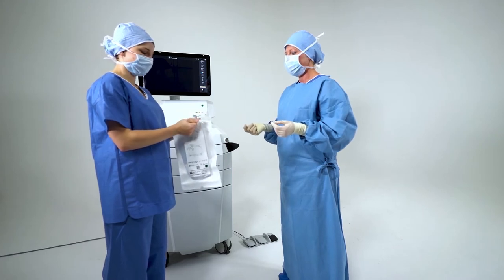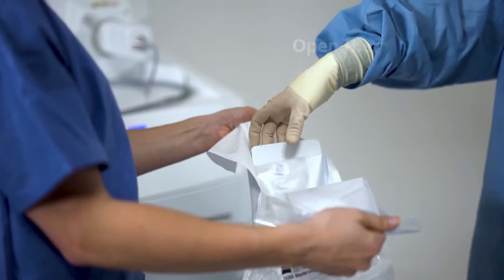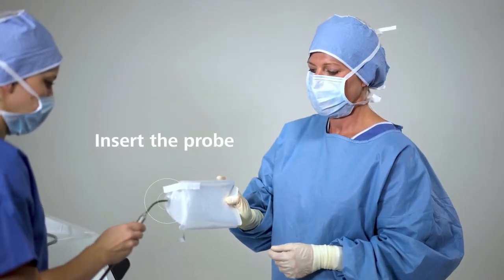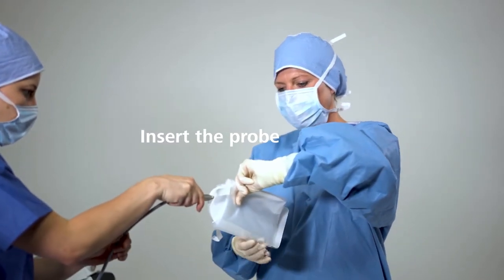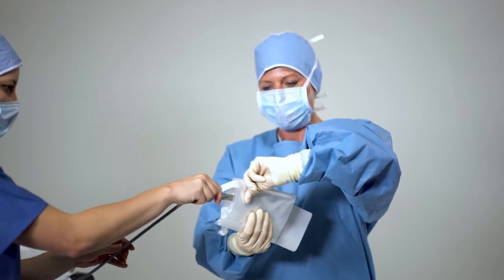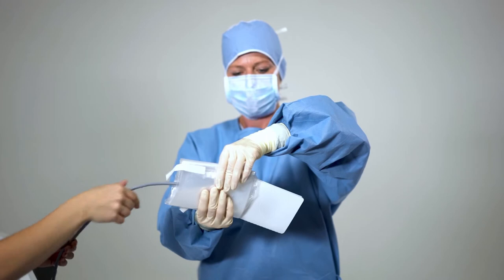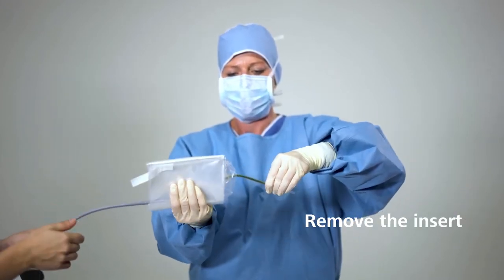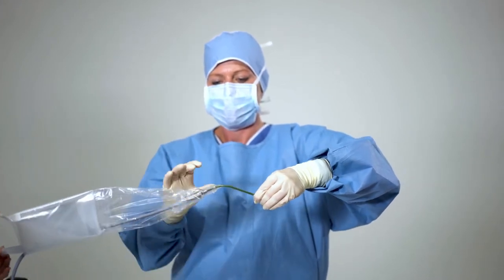The non-sterile nurse opens the ZEISS Sterile Sheath pouch for the scrub nurse. Both pull-off tabs point towards the non-sterile nurse. The non-sterile nurse inserts the scanner probe into the opening of the sleeve. As soon as the shaft tip of the scanner probe appears on the other side of the drape pack, the sterile nurse removes the plastic insert and completely pulls out the probe with the sterile sheath.